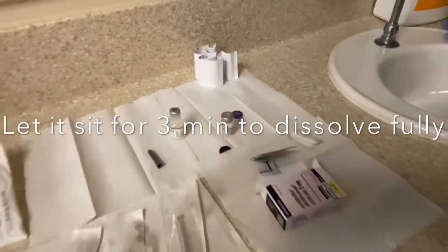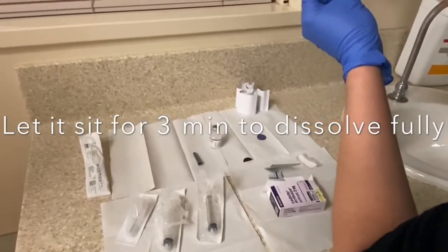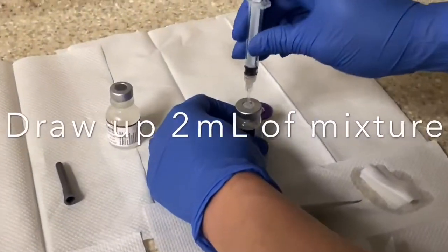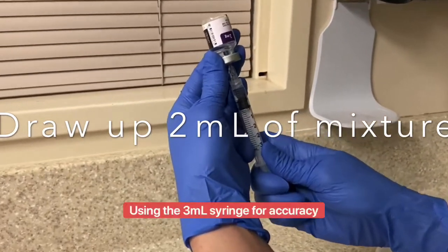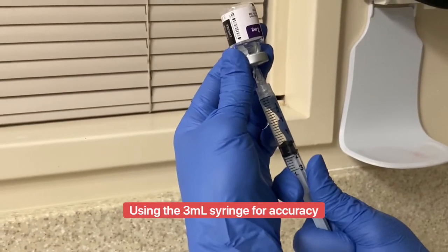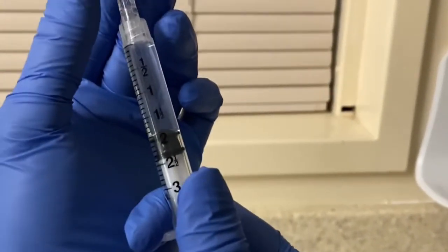Then go ahead and grab the same syringe with a blunt needle and withdraw the solution. Draw up 2 ml — not 2.2, just 2 ml — because we want 1 ml in each syringe. Draw up the 2 ml of the mixture. Again, use the 3 ml syringe for accuracy; it's easier to see. There's the 2 ml right there — make sure there are no bubbles.